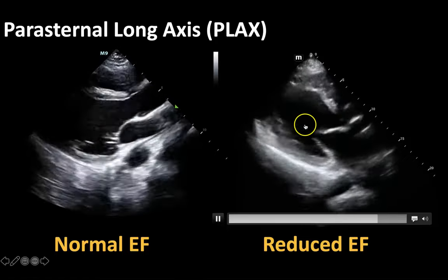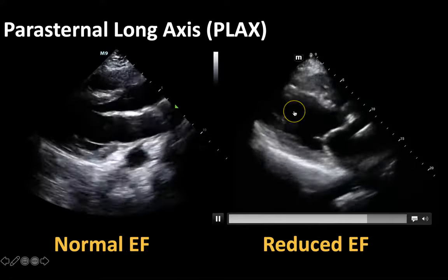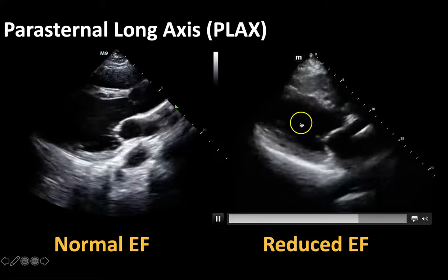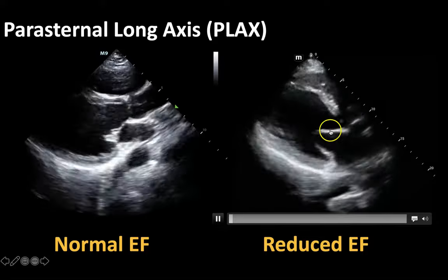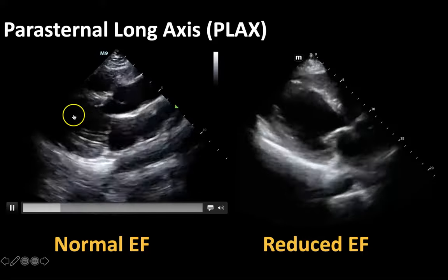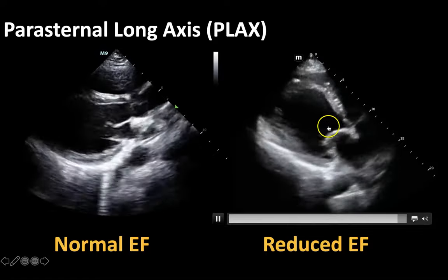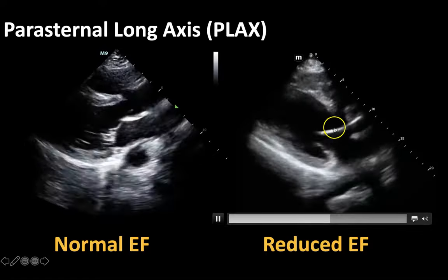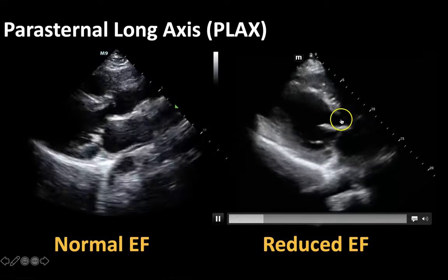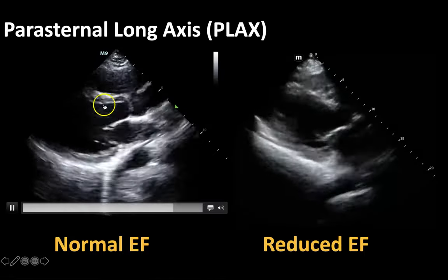You can see how the walls of this ventricle are not coming anywhere close to that imaginary line in the middle, like it is on the heart on the left side of the screen. You can also appreciate that the anterior leaflet of this mitral valve really is not coming anywhere near the septum either, compared to the healthy one that's coming close to the septum over here.